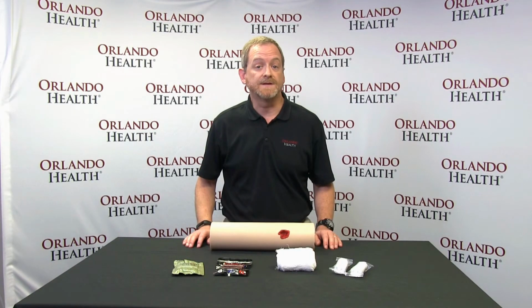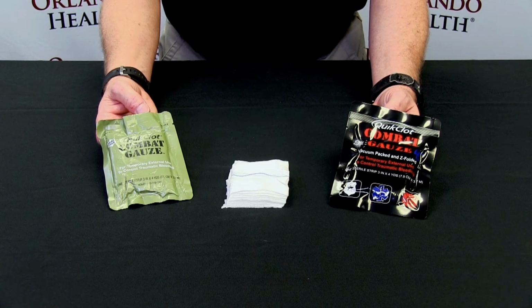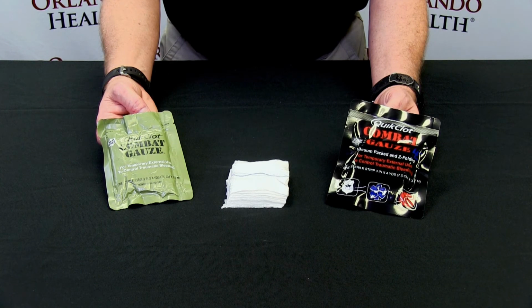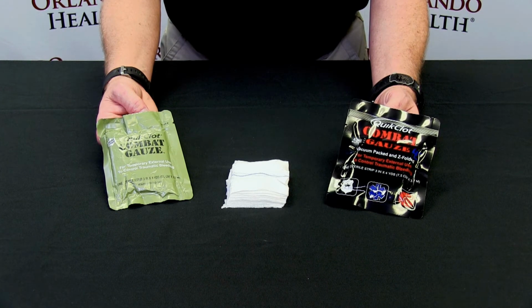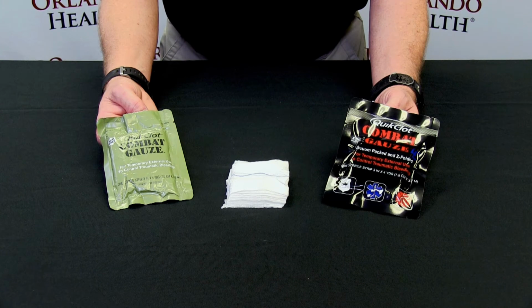There are 2 main types of gauze that you can place in your Stop the Bleed kit: hemostatic and non-hemostatic. Hemostatic gauze is gauze that has been treated with various agents to help the victim's body stop bleeding. You can buy hemostatic gauze online or in your local camping store. It can get a bit expensive, with a package of quick clot combat gauze or Celox running $20 to $40 each.